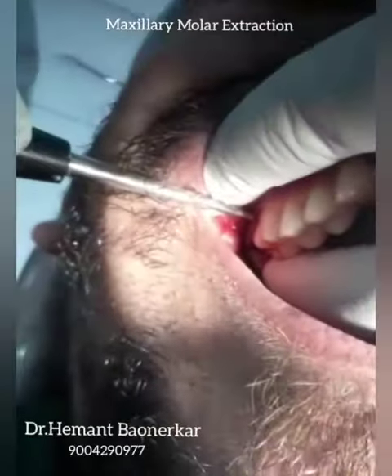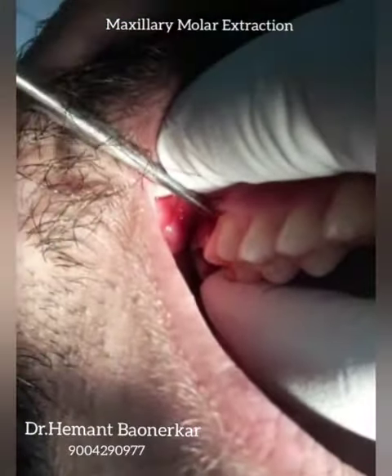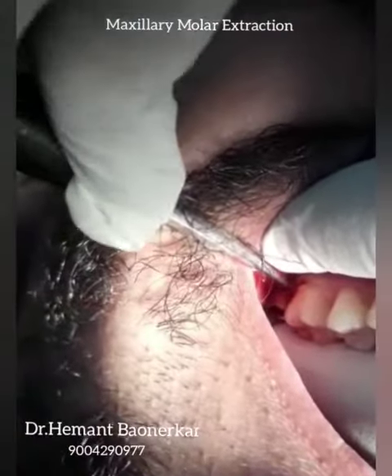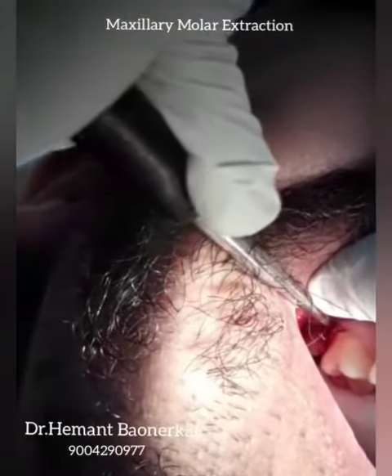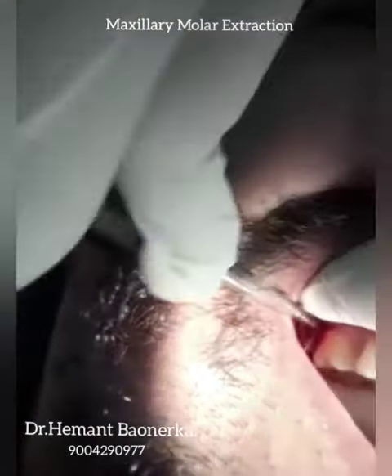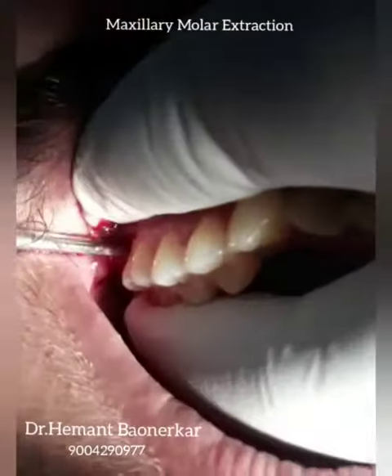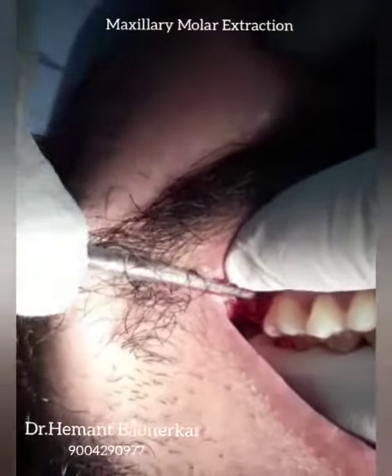Give attention to how I am holding the elevator perpendicular to the tooth. Now I am luxating with the Warwick James straight elevator. See how delicately I am elevating the tooth — now my tooth is starting to luxate.